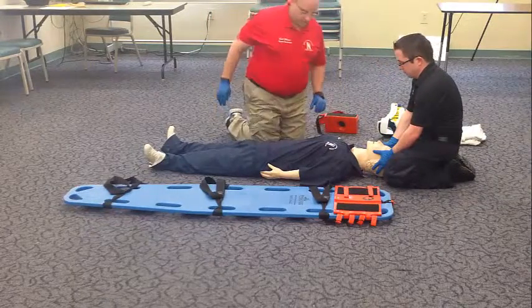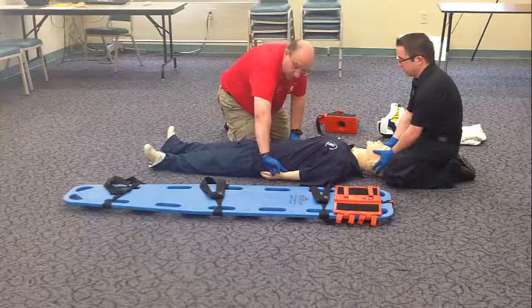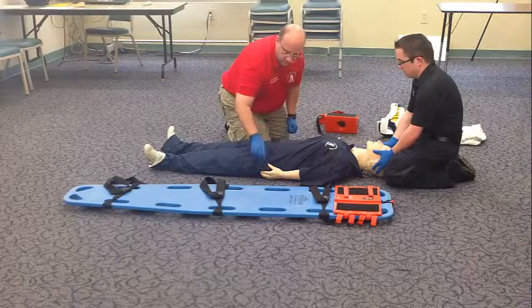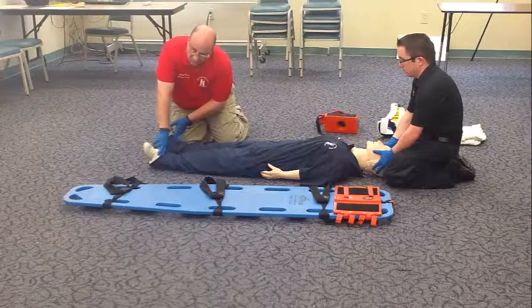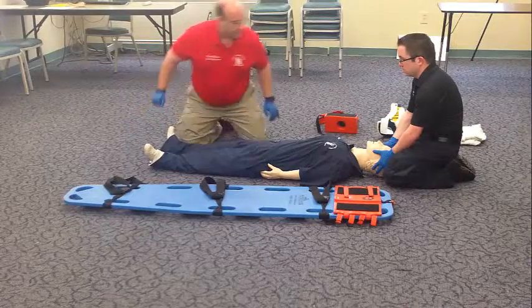I'm going to come and assess pulse, motor function, and sensation in all four extremities. Do you detect pulses? Can you feel this? Can you wiggle your fingers? The response is yes. I'm going to check pedal pulses. You have pulses. Can you feel this? Can you wiggle your toes? The response is yes.